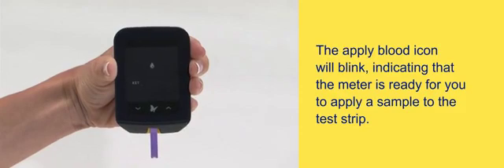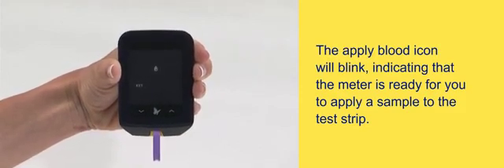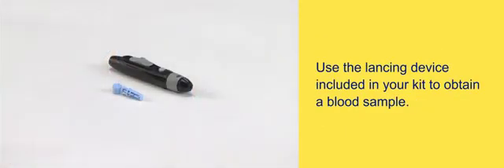The apply blood icon will blink, indicating that the meter is ready for you to apply a sample to the test strip. Use the lancing device included in your kit to obtain a blood sample.